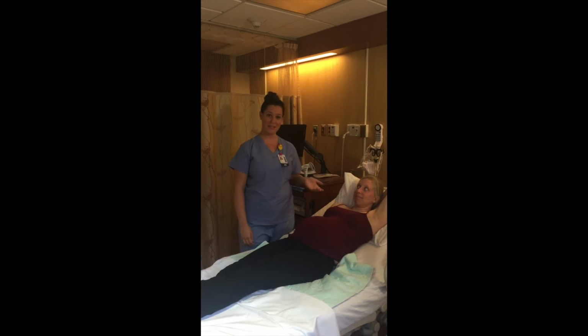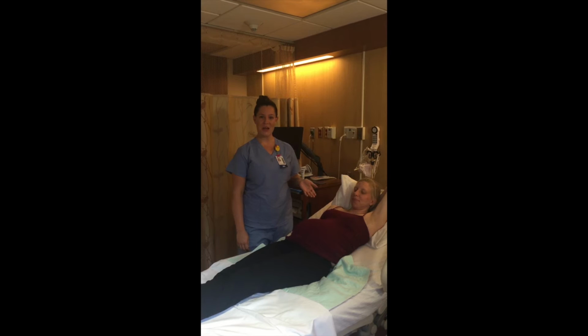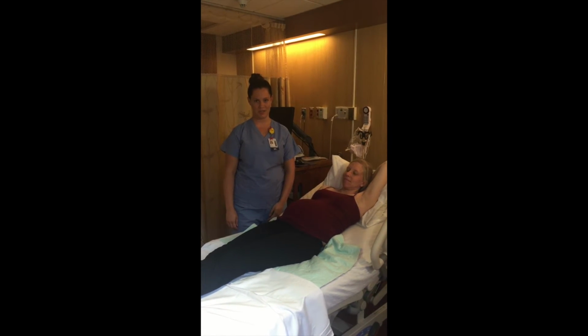With all that being said, we are now going to demonstrate how to use intermittent auscultation on a laboring patient in different positions. This is Christy, and she is a low-risk laboring patient that just arrived to triage. We went through the checklist, and she is technically a great candidate for intermittent auscultation. I am now going to walk through the steps of intermittent auscultation.